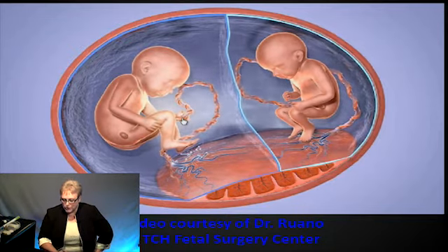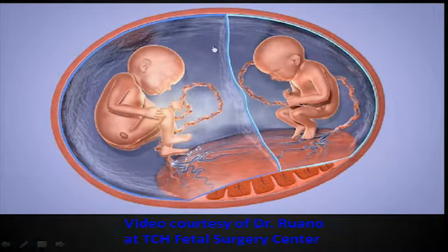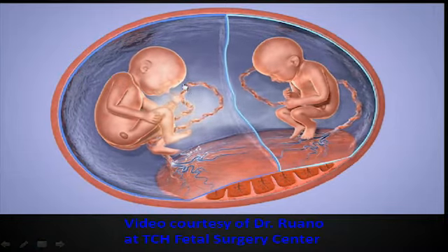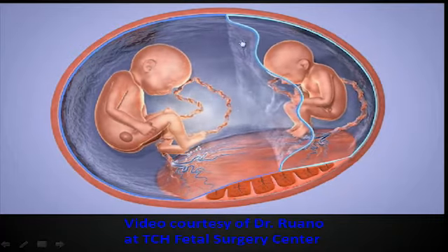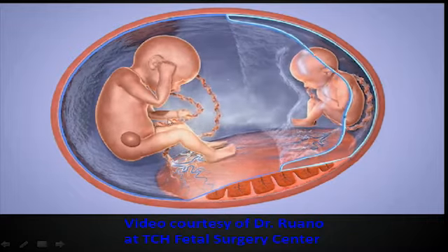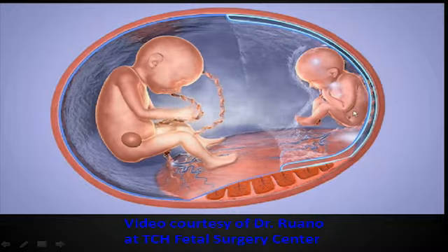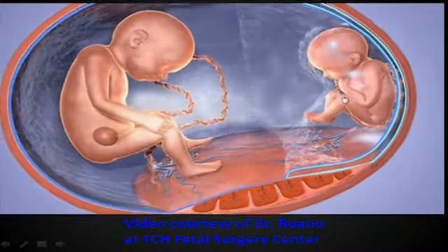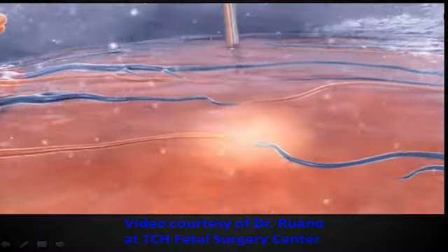So this is courtesy of Dr. Ruano. It kind of shows what happens with our twins. So we can see this baby is going to be our recipient. This one is our donor. So the membrane kind of comes over here and it's pushing that baby over there. You can see how this baby is getting bigger. Look how the bladder's getting bigger, and that one's getting smaller. And this kid is just kind of saran wrapped over there to the side. So now you have the membrane pushed right against that baby.